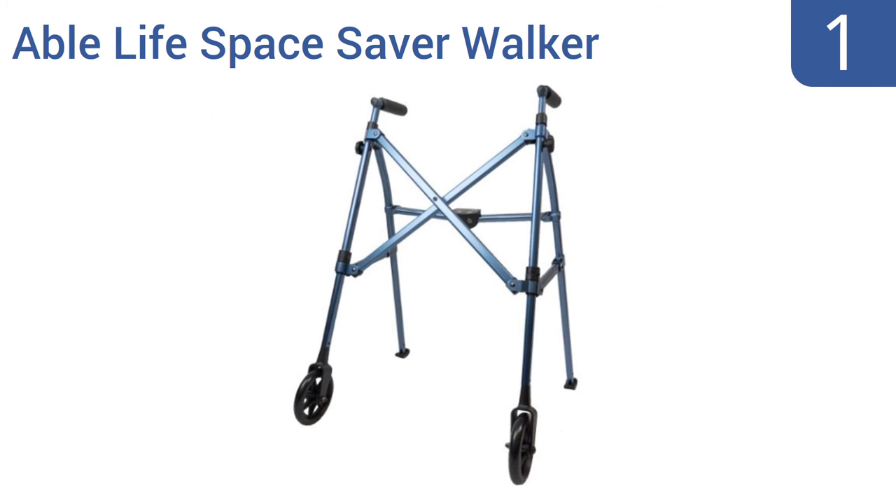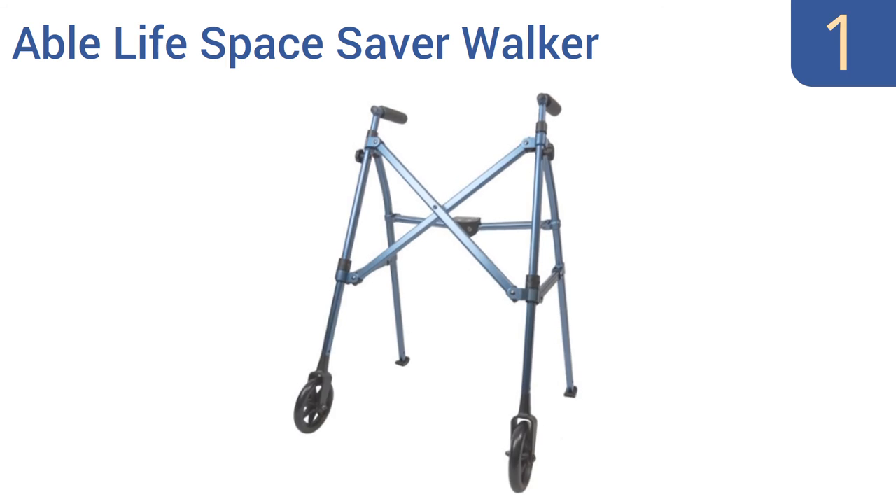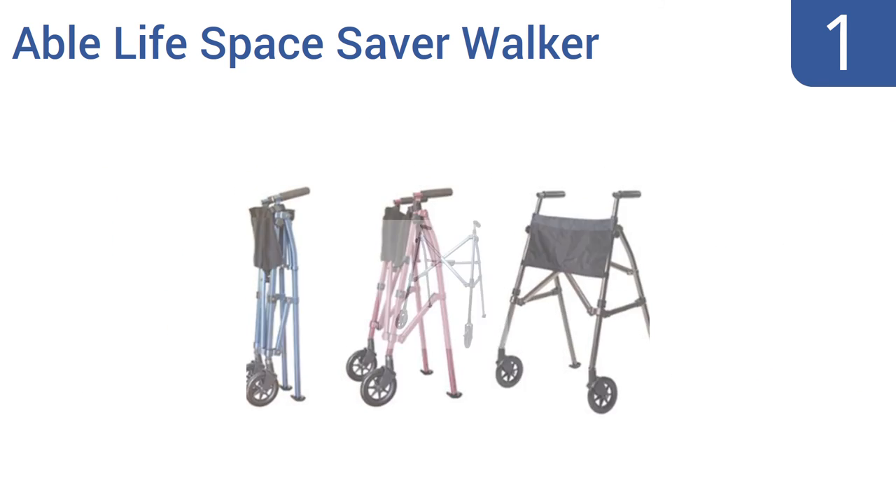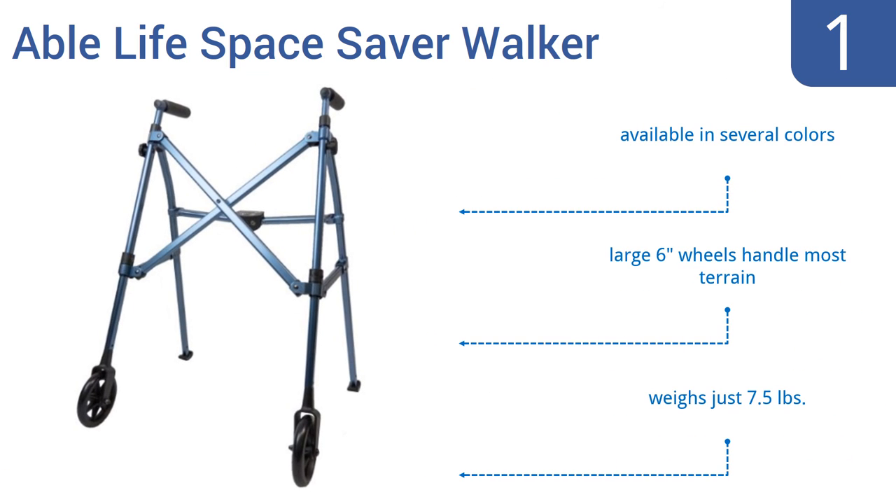And coming in at number 1 on our list: the Able Life Space Saver Walker can support the full weight of a larger adult with ease, yet it can be collapsed down to a package measuring just 7 inches across for easy transport and storage. One lift of a tab placed at its grips is all that's required for folding. It's available in several colors, features large 6-inch wheels that handle most terrain, and weighs just seven and a half pounds.